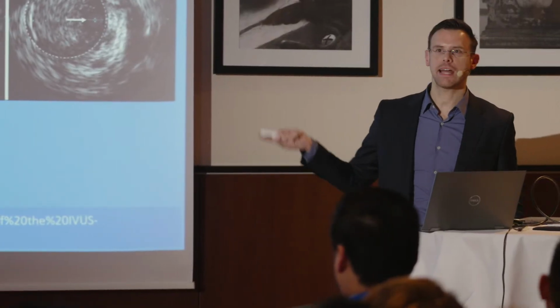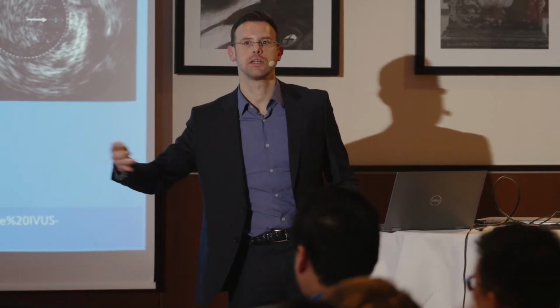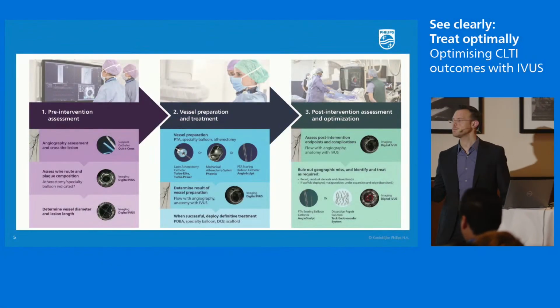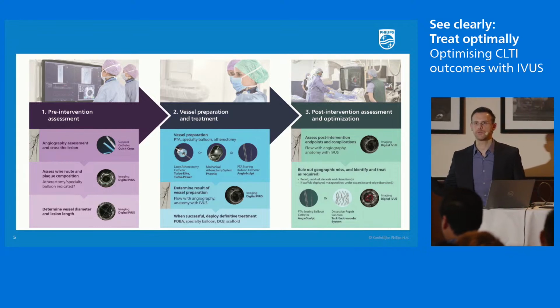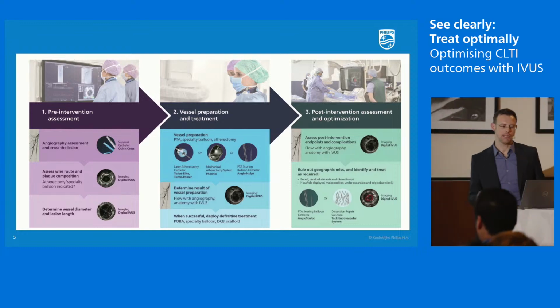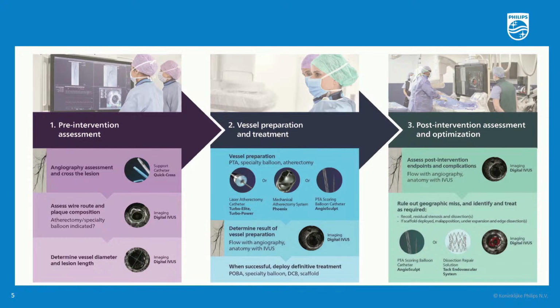Have we gained lumen? That is the point. That's why we're there. Have we achieved it? And in which case, do we need to do anything else to maximize the benefit from our procedure? Now, this is something that I saw about a year ago. Has anyone else seen this? This was, I thought, a wonderful way of representing this, and this was produced from our friends in the image-guided therapy team at Philips. And this really kind of summarizes what I've just told you.